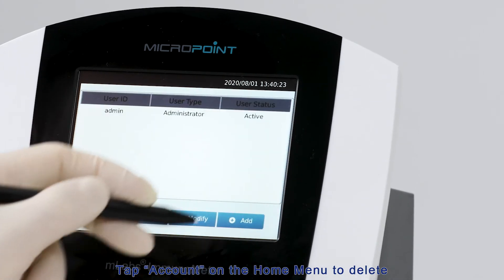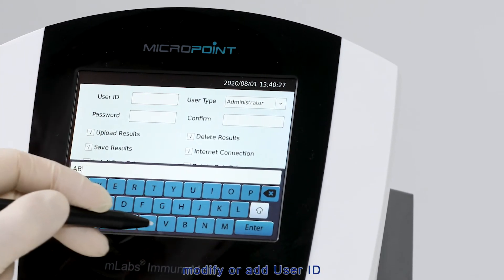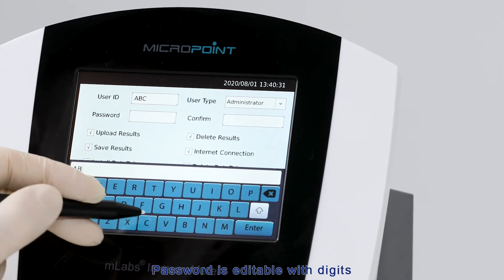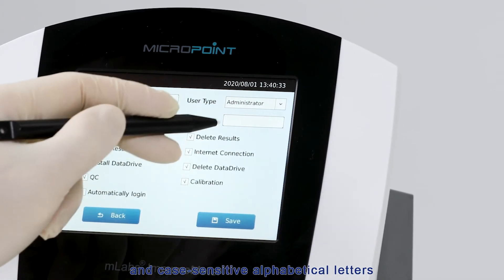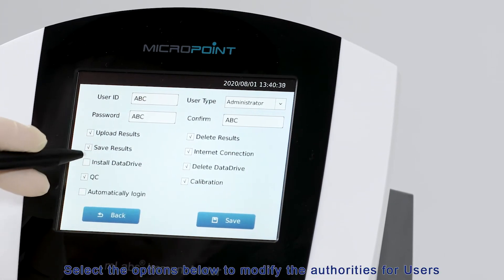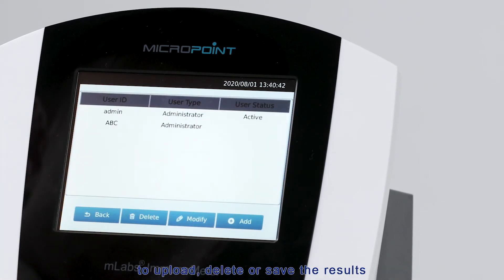Tap Account on the home menu to delete, modify, or add a user ID. Passwords are editable with digits and case-sensitive alphabetical letters. Select the options below to modify user authorities: to upload, delete, or save results; to install or delete data drives; to run QC or calibration; and to connect to the internet or enable auto-logging.